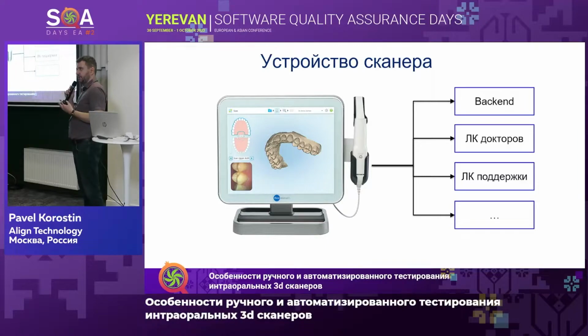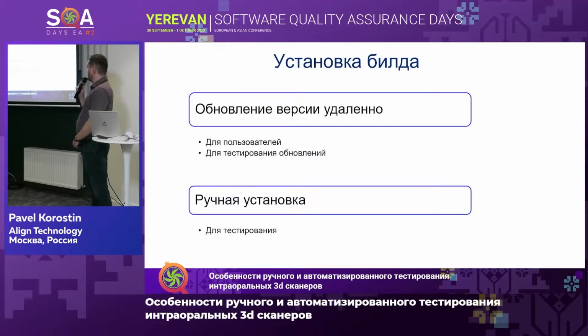Instead, we need a scanner or some other machine like a desktop where you can install the software and do the testing. The only kind of environment we need is one for test cases and integration with the backend.